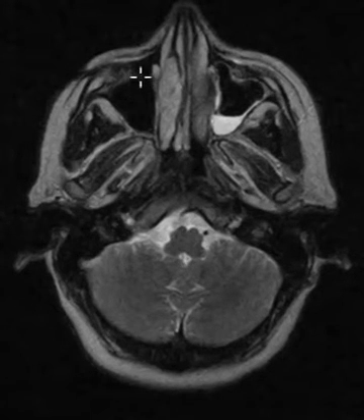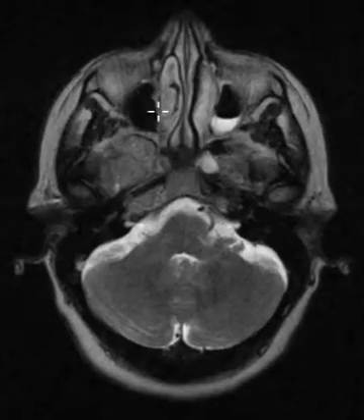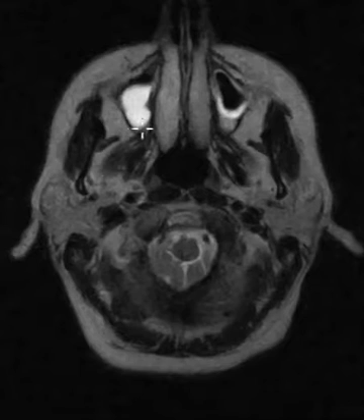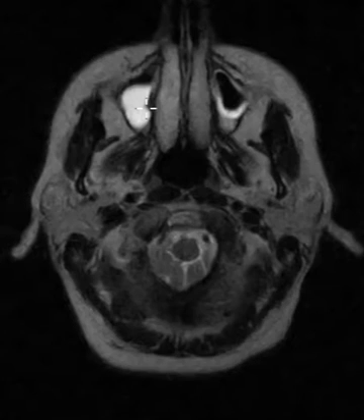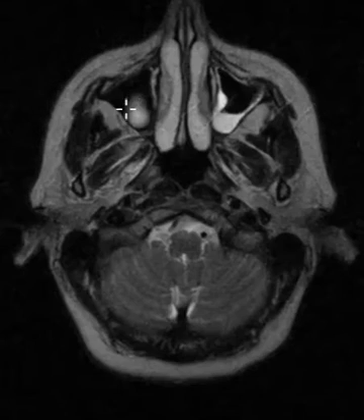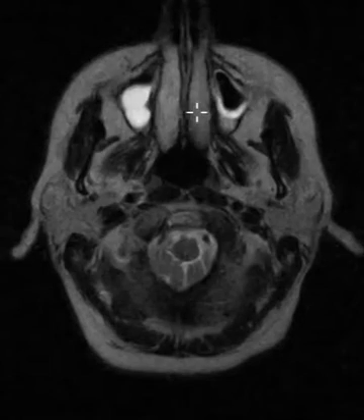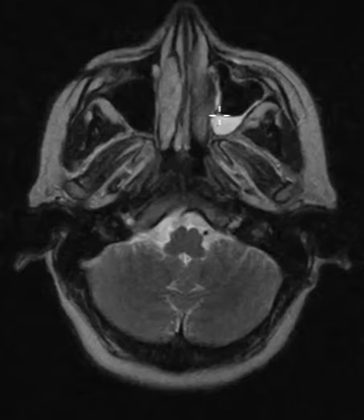Now that you're oriented, you can see the right maxillary sinus looks good. If we go to the top it looks good. If we go to the bottom there's a little round area that's very bright. This is just a retention cyst — a benign little cyst, very very common. It looks rounded and is not worrisome at all.